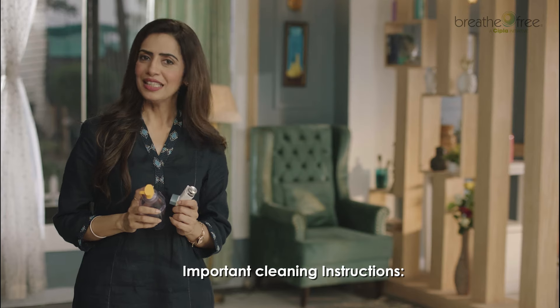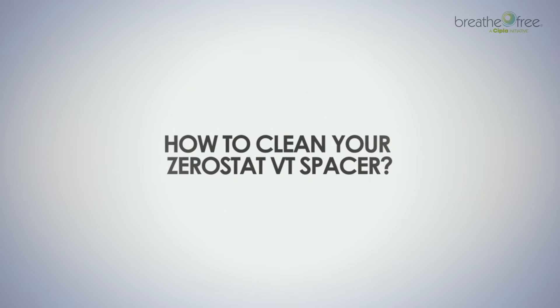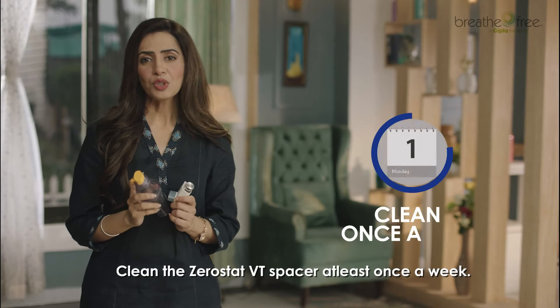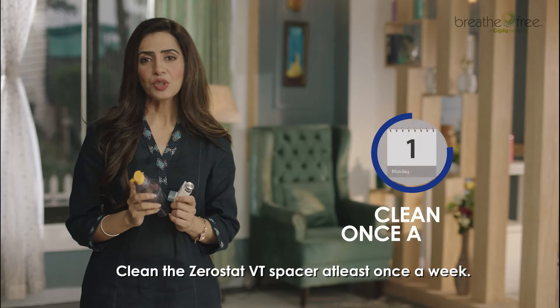Inhale slowly and deeply. Remove the Zerostat VT spacer from your mouth and hold your breath for about 10 seconds or as long as you're comfortable. Then breathe out normally. Alternatively, keep your lips firmly closed around the mouthpiece and continue to breathe normally three to five times.